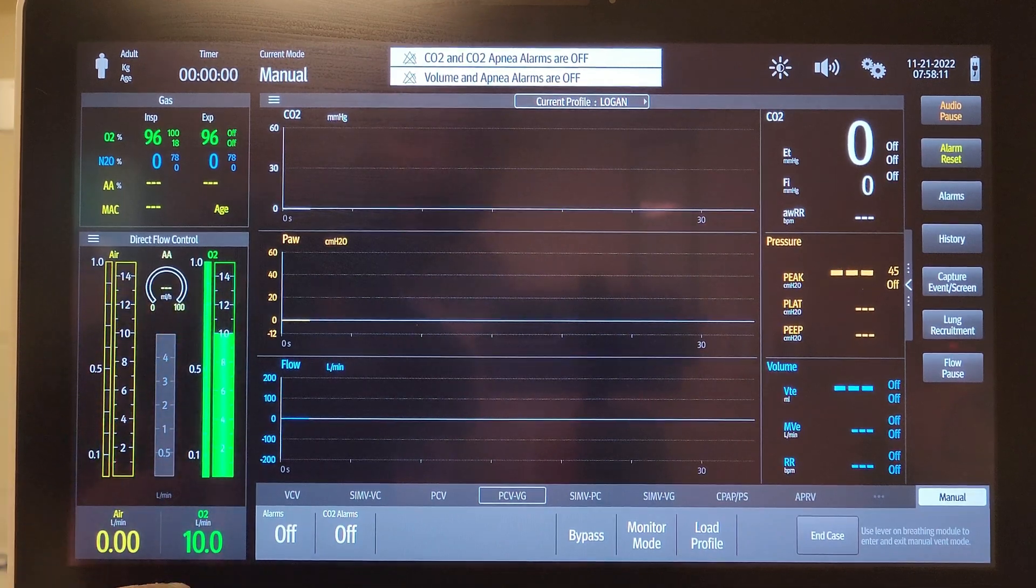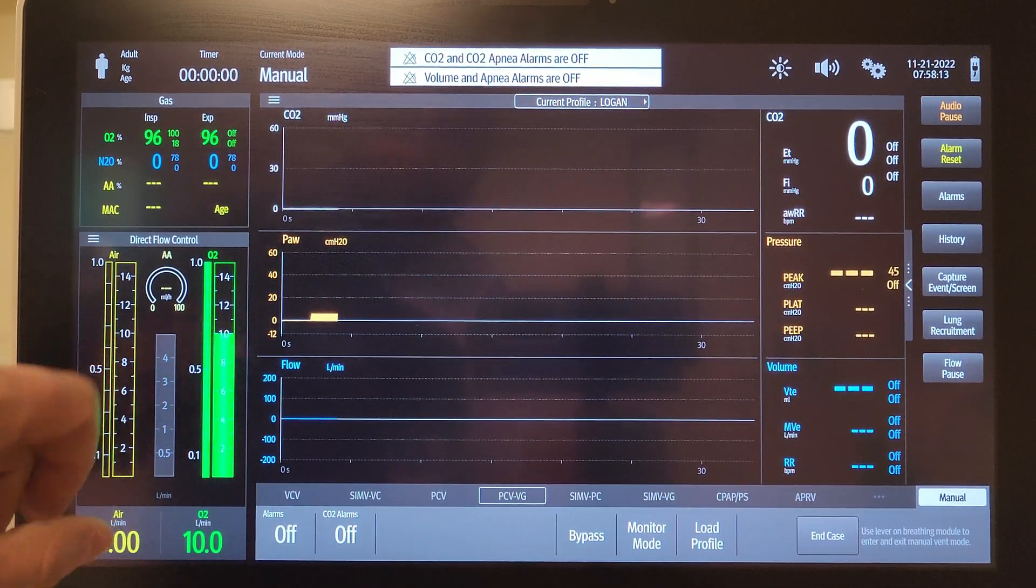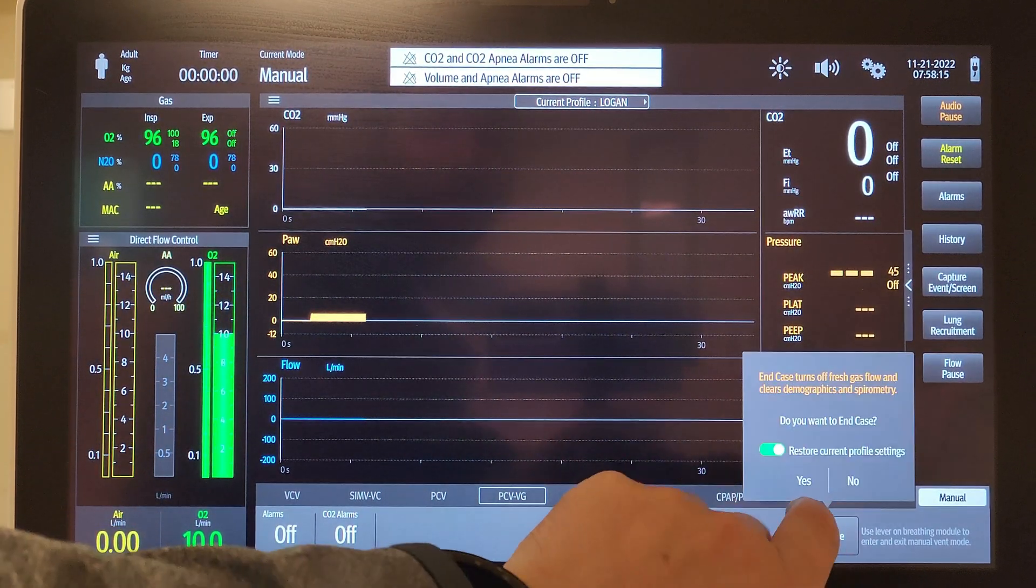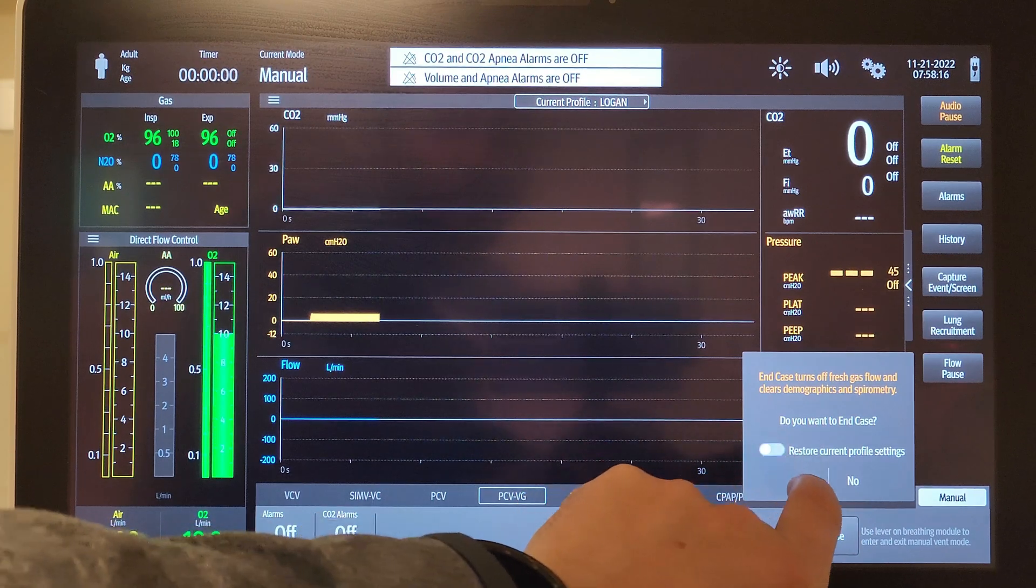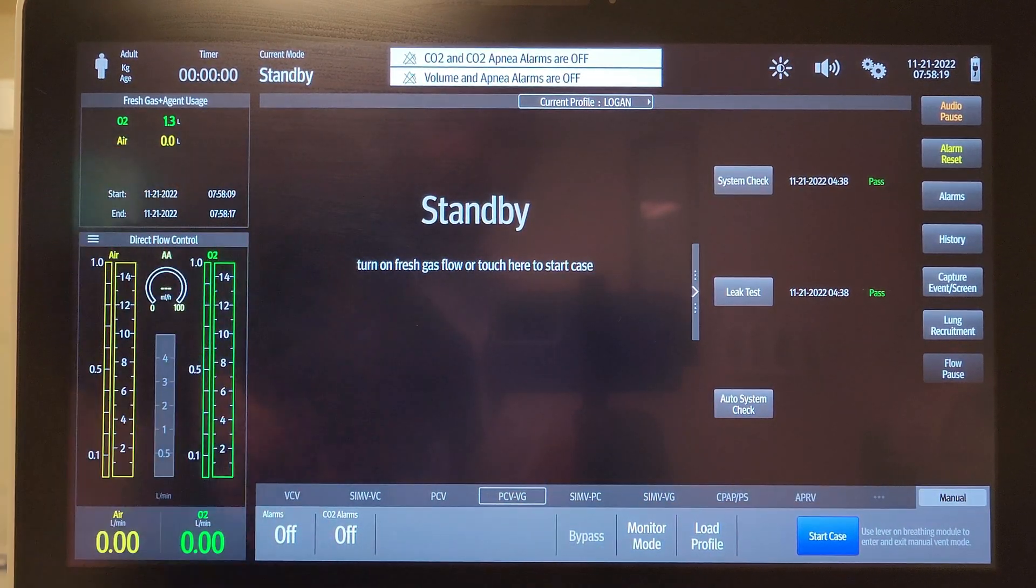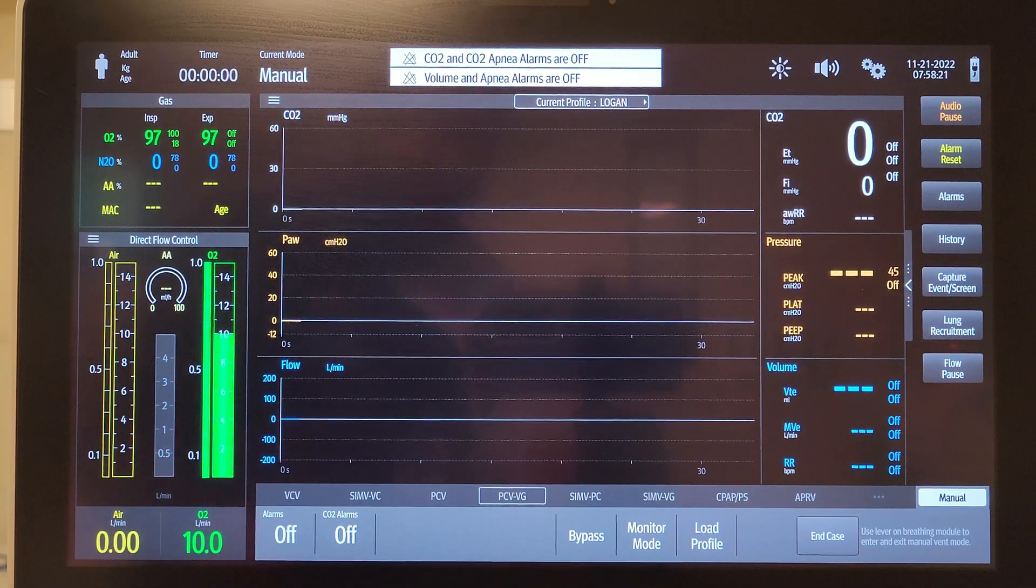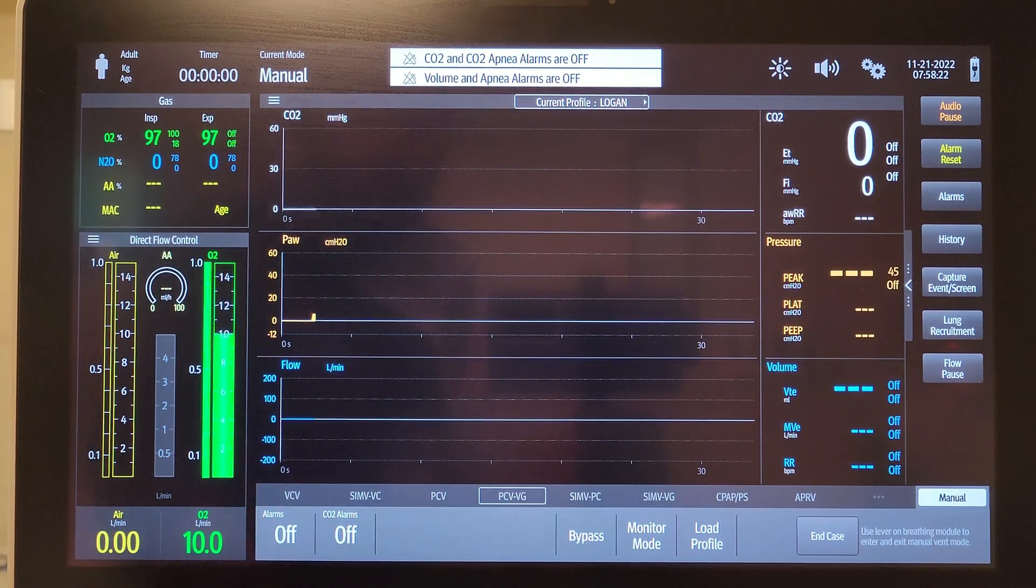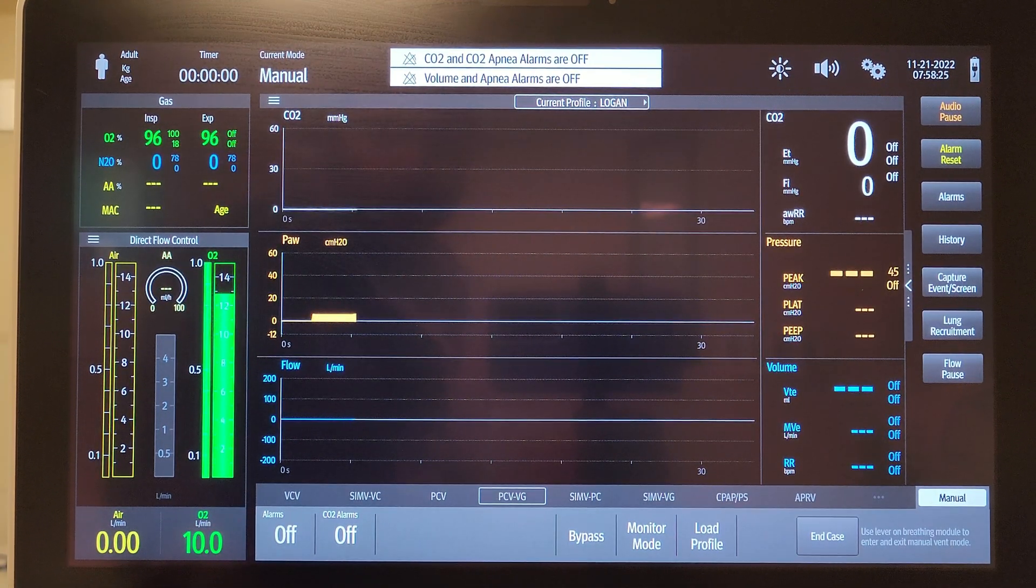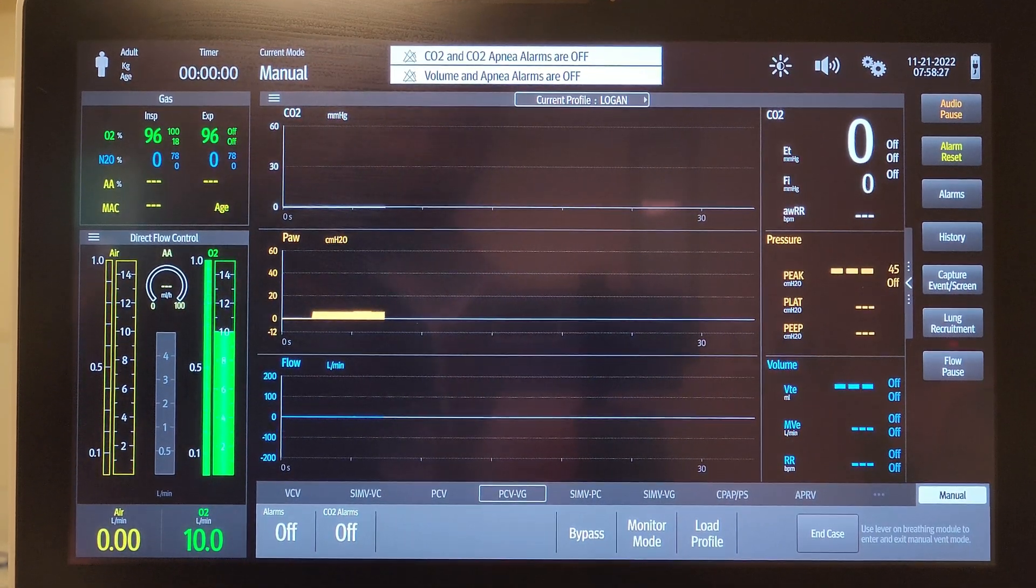It'll automatically go to oxygen at 10 liters. An additional way of doing this is to tap anywhere. That will also do the same thing, or you can just manually turn this up to the desired oxygen amount.